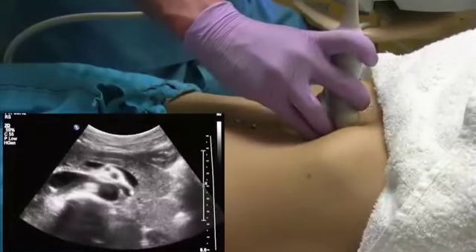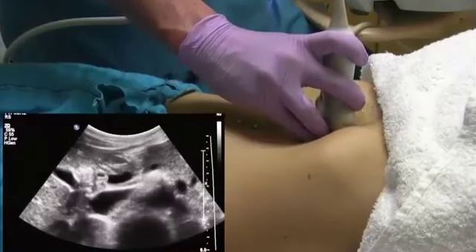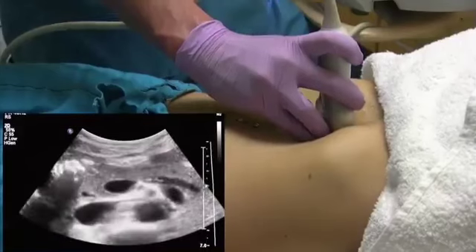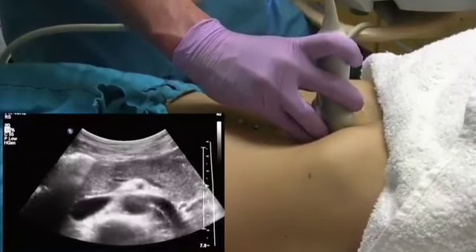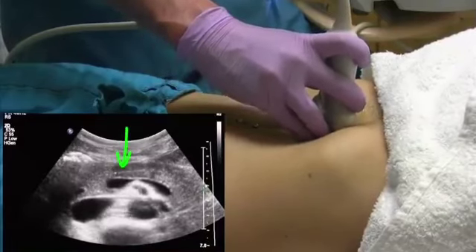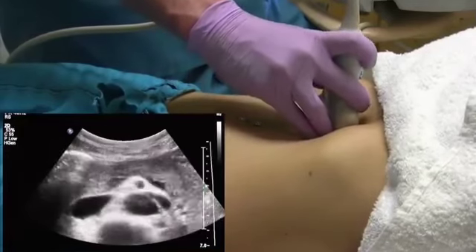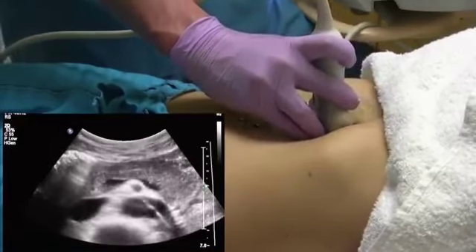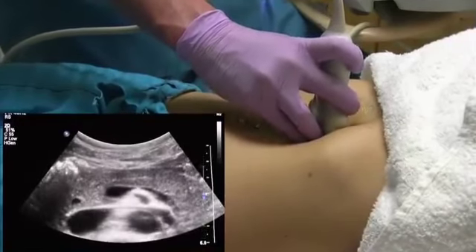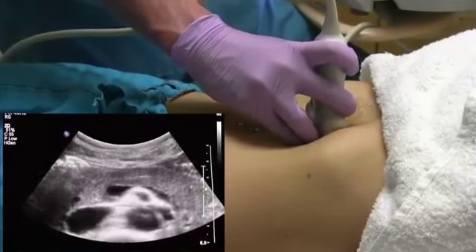When you're looking at the pancreas, you want to look for certain structures. One of the structures that we can look for is the pancreatic duct, and that runs right through the body of the pancreas, throughout the entire length of the pancreas. In a lot of patients, you will be able to see the pancreatic duct, and we usually use 2 millimeters as a cutoff for our normal pancreatic duct measurement.